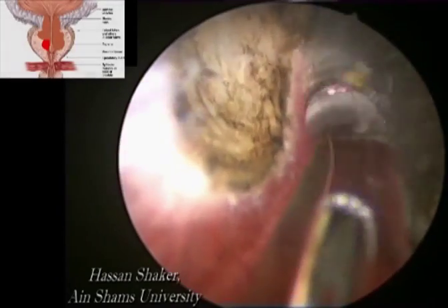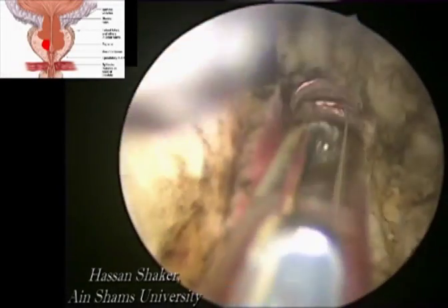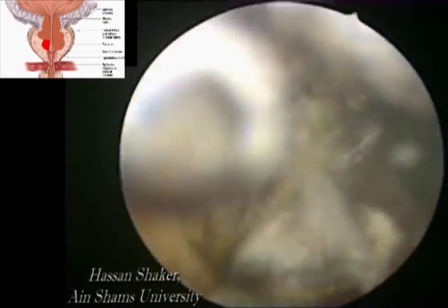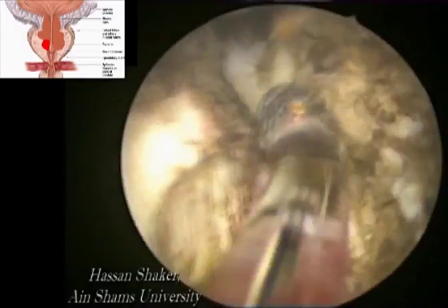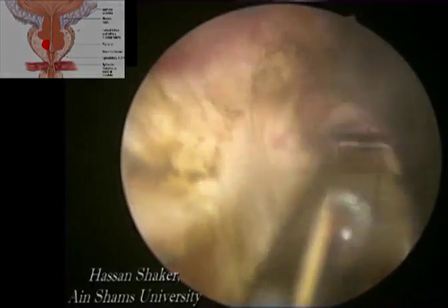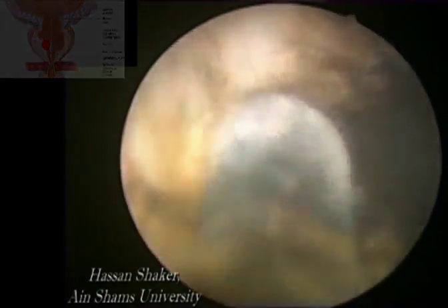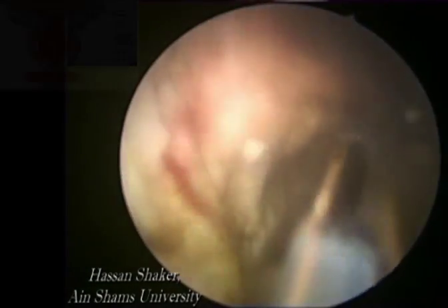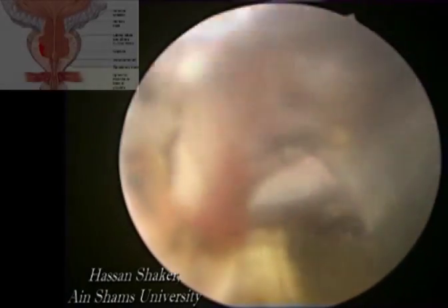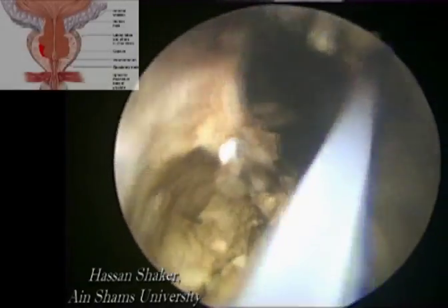After finishing the proximal half, the distal half is then ablated similarly in layers. It is shown how easily this fiber and 980 nanometer laser control the bleeders.